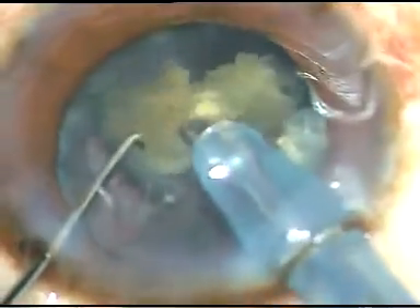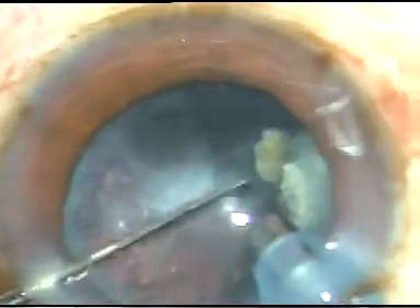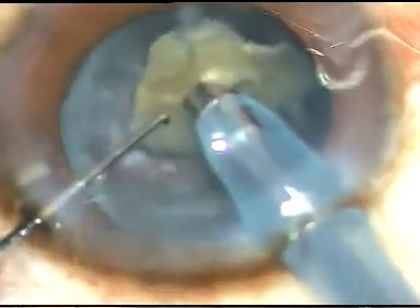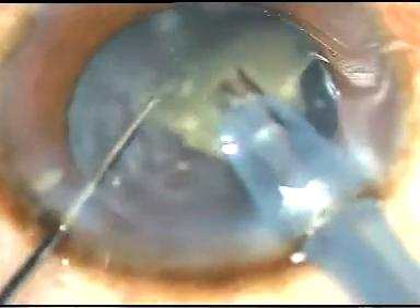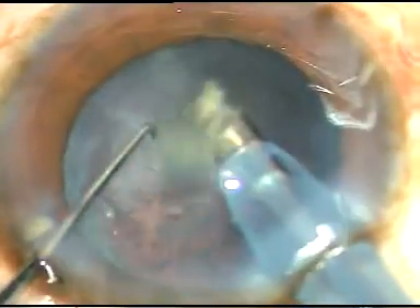The nucleus is almost removed; only a small fragment remains. With the help of the left-hand instrument, I bring it to the center, and I apply ultrasonic energy on this, emulsify it and remove it.